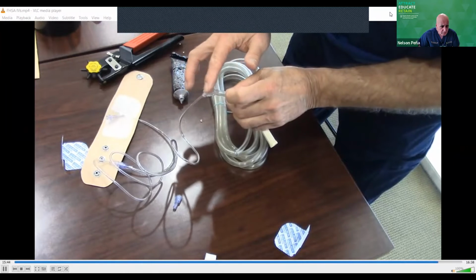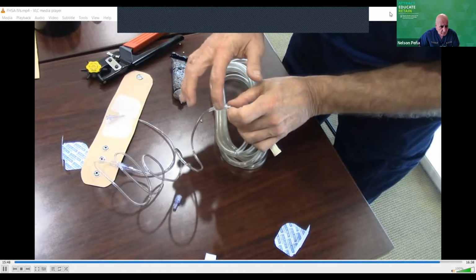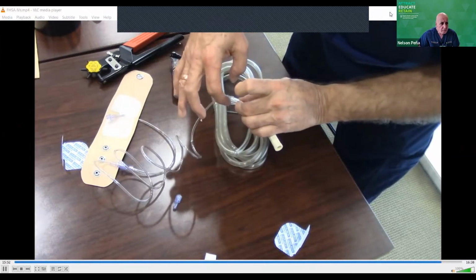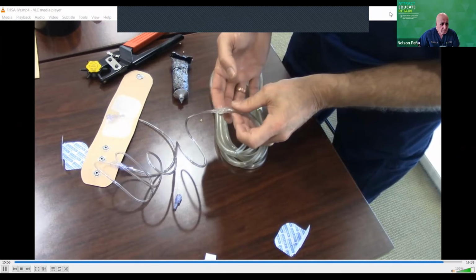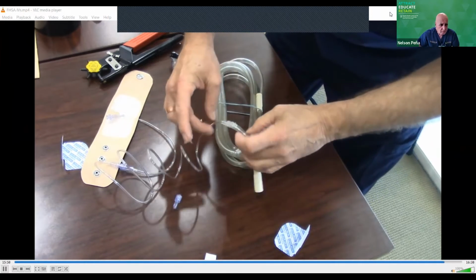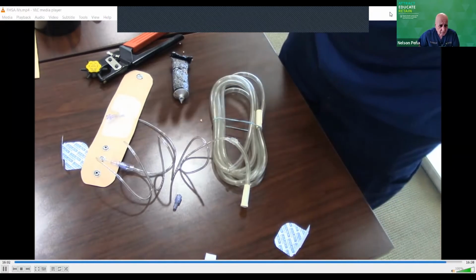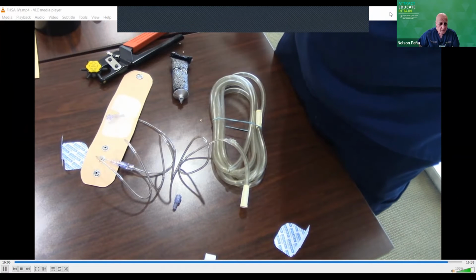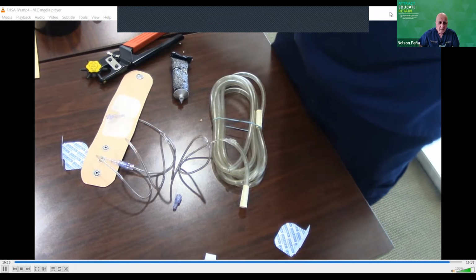And then you can round it off, make it look nice and pretty. Smooth it out. And this is more about function than it is about beauty. So once you have it in there, now all we need to do is let this dry for 24 hours, and voila, we have suction connecting to an IV, an external IV that we can use on any simulator.